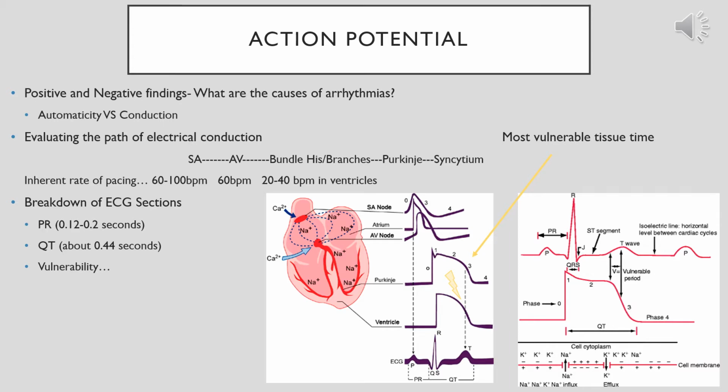This is covered in detail in ACLS, which I'm not going to get into deeply, but that's a big reason why we need to have a patient hooked up to a monitor and evaluating their rhythm before doing any kind of pacing or electrical impulse shock.